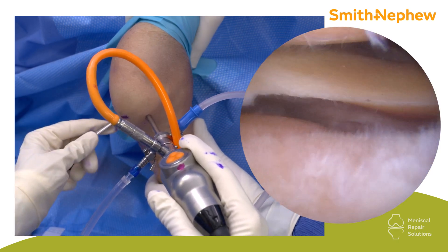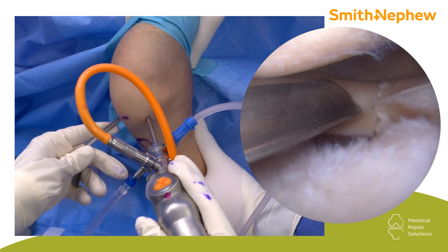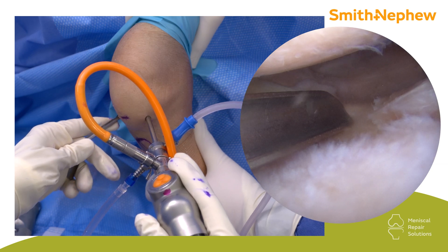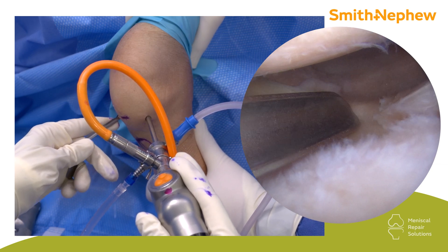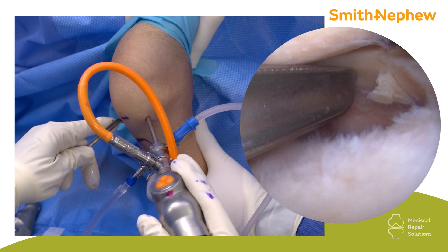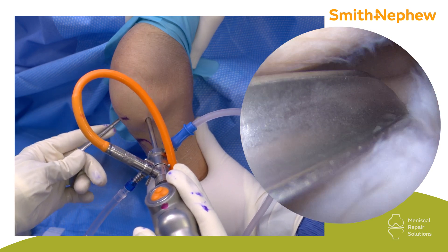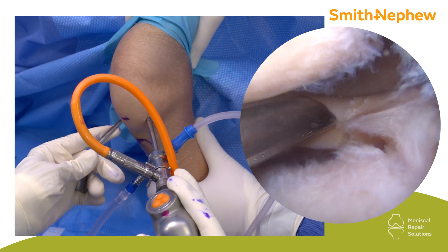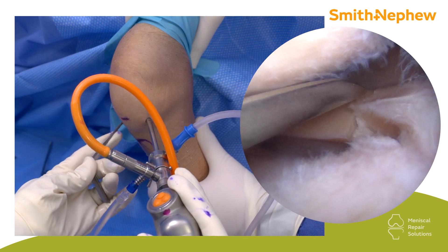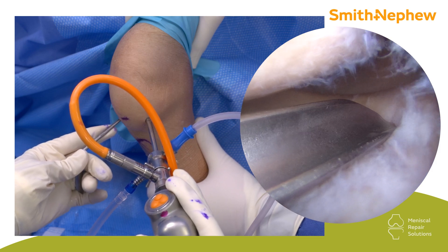This is a very nice tool — it will enable you not only to deliver the FastFix to the spot, but in some instances you can also retract the meniscus. If I want to go underneath the meniscus, I can do this. In this case I'm going to go on the upper surface here and here. Before I commit to introducing the FastFix, I'll assess if I can reach both sides, and I usually start with the one that's a bit harder.